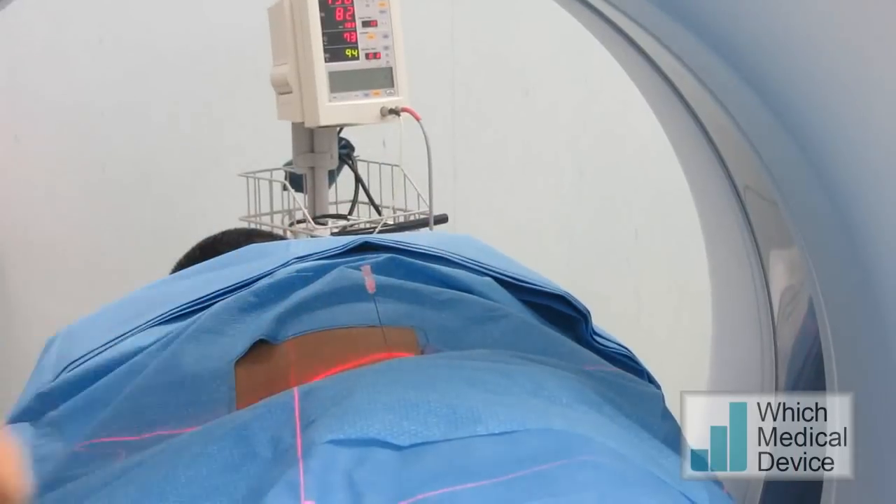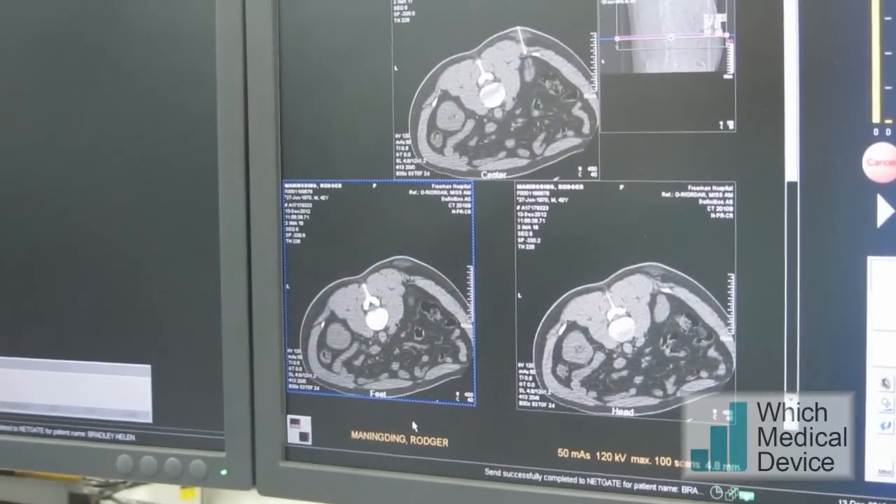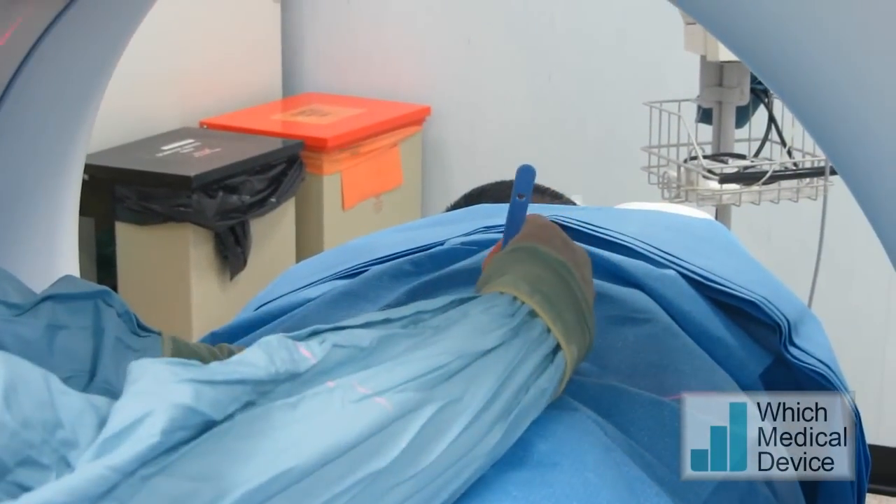Just going to check our position. Take a small breath in now, hold it there. So that looks bang on target. Just going to make a small nick.